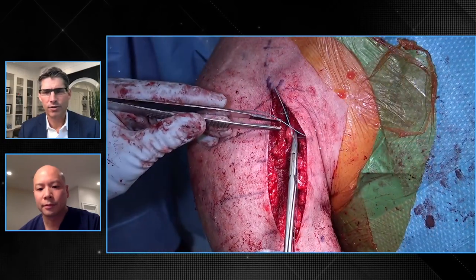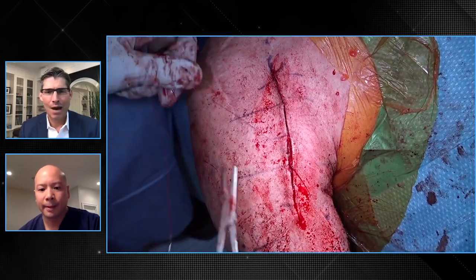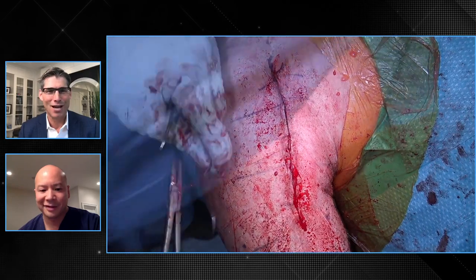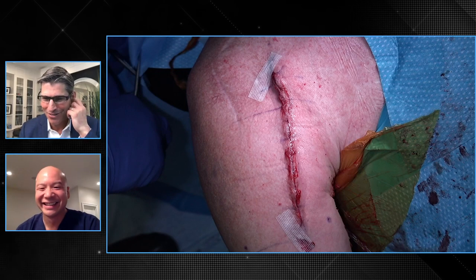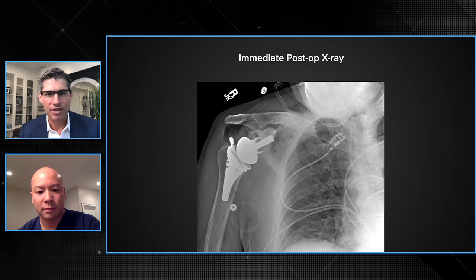That's exactly how I do it as well — it was probably the big learning curve for me changing from 155 to 135 and the mode of instability. That was an awesome video — you made surgery on a big guy look very easy. Let's see the final product. That looks perfect. One of the things I look for is that lateral offset and the durability of the construct. I don't want to see a lot of length, which you've really established nicely — there's not too much length to the system. You've got inferior tilt to your base plate because of your augment. That looks like a home run to me. Anything you'd be unhappy about?